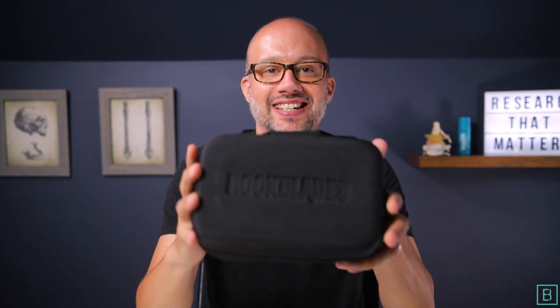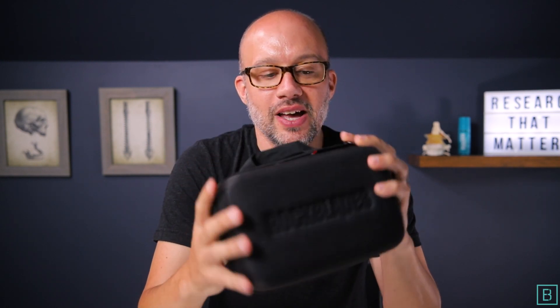Hey everybody, what's going on? My name is Dr. Jeff Langmaid with The Evidence-Based Chiropractor, and today we are going to take a look at RockBlades Mohawk by RockTape. This is an awesome soft tissue instrument, so if you are a movement specialist, physical therapist, or chiropractor and you do soft tissue work in your practice or clinic, RockBlades Mohawk is something you're going to want to take a look at for sure.